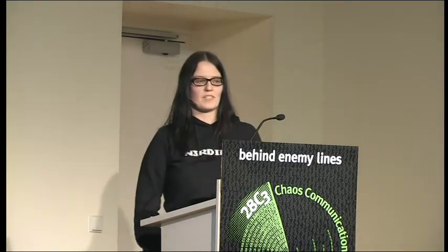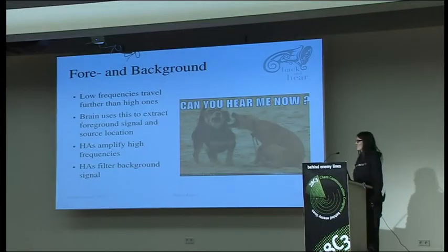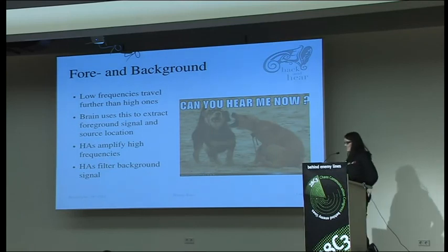Sometimes exactly the person that is talking to you gets faded out, because it's considered noise. But sometimes they also work pretty well. It's also coincidence. Sometimes you're in a setting which has exactly the situation that the hearing aid can work well with. So sometimes you are here with a hearing person, and you hear him quite well, and then you start talking in a normal voice because you can actually understand everything, and then the hearing person asks you to repeat a sentence. This is really weird sometimes.